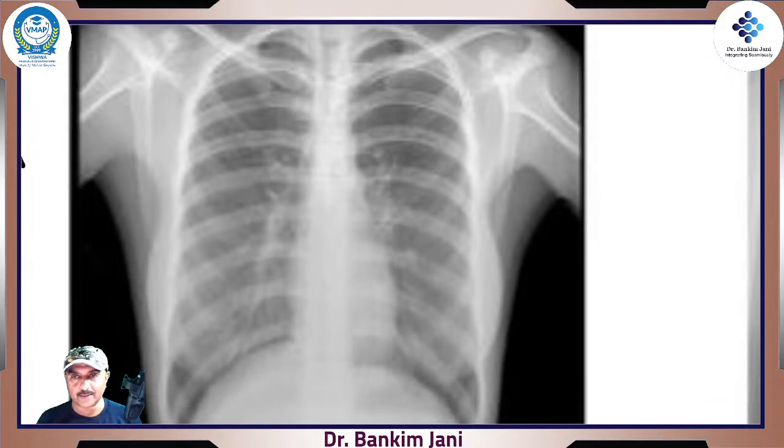In this X-ray, I'll mark the anterior end. See the anterior end, right? Here it is. The lower rib, here is one. Another one, this one, right? See the anterior ends, they are seen so clearly. These are the anterior ends.